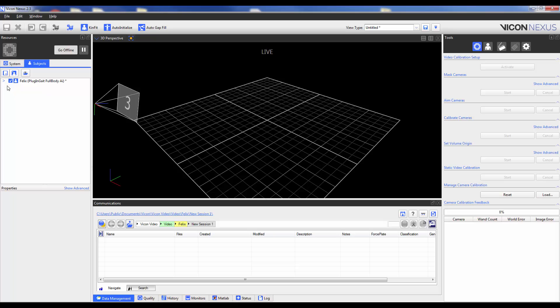To see the marker list, I am going to expand on the subject, and then expand on the marker list. Here I will see all the markers which comprise the template, and right now they are all in gray because none of the labels have actually been applied to any markers on the screen.